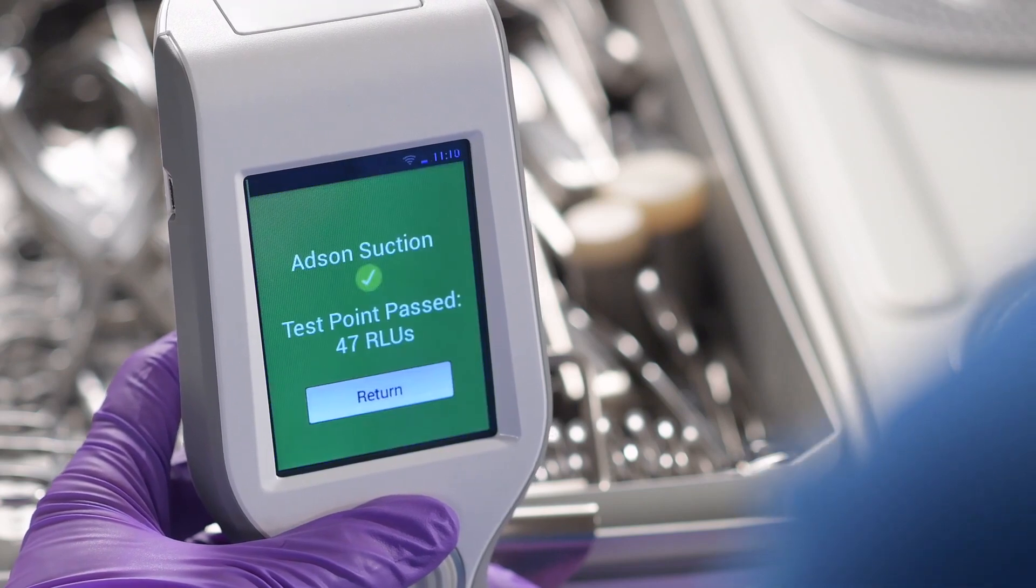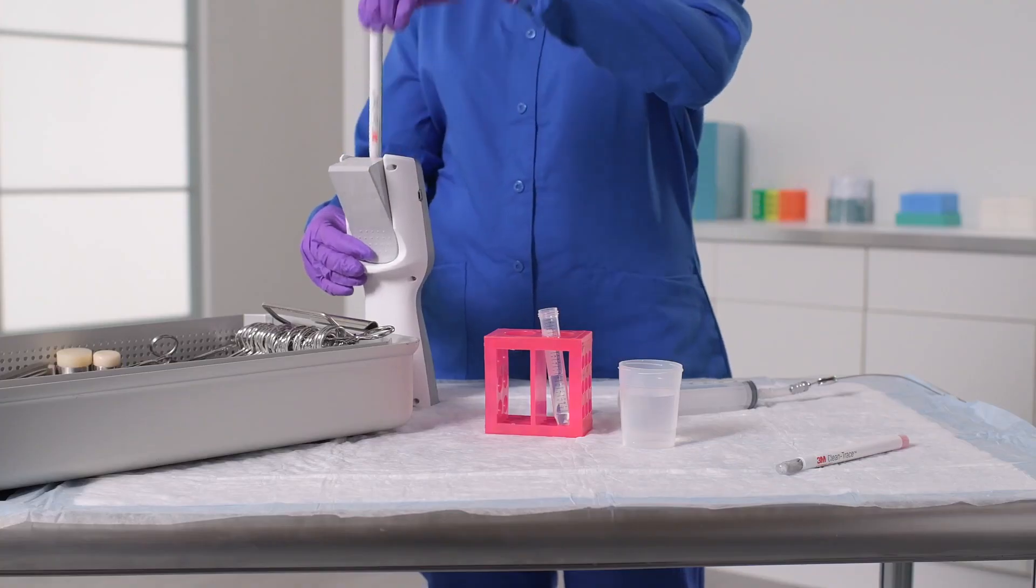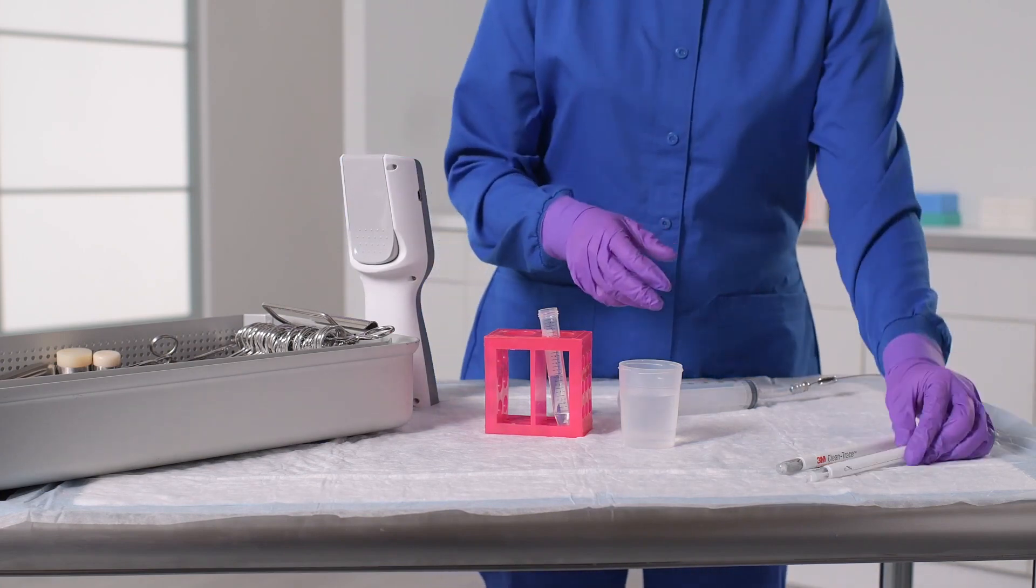The more contamination there is, the more ATP there will be, resulting in more light being produced and a higher RLU value.